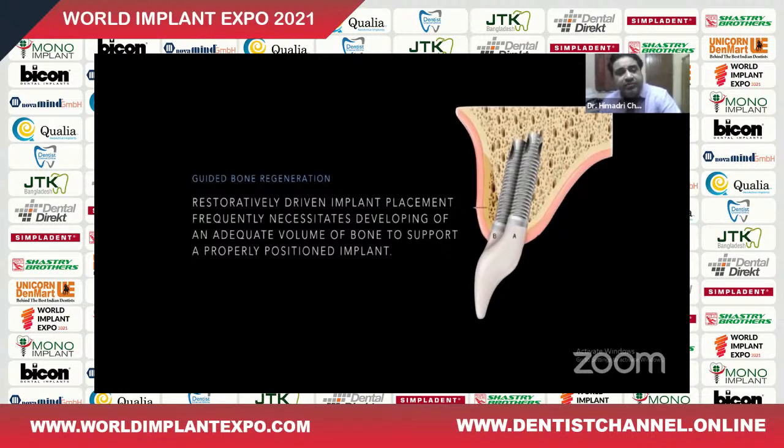So restoratively driven implant placement frequently necessitates development of adequate volume of bone, because if you want to place the implant in the best bone, probably you don't require the placement of bone grafts or volume augmentation. Unfortunately, placing the implant in the best bone doesn't give you the best position in terms of the crowns or the bridges. So to give the best restorative position of the future crown and bridges, you require to place the implant in the right place. And most of the times you find the resorption pattern of the ridges is such, where extraction has been done previously, that to place the implant in the right prosthetic position, you will have deficiencies of bone. So you need to augment those cases.